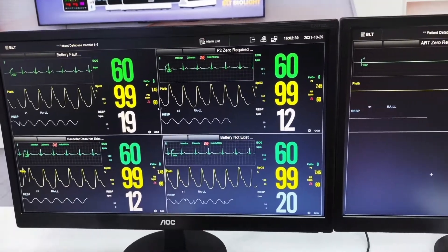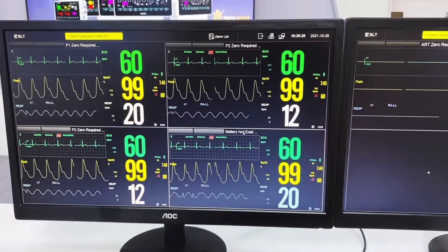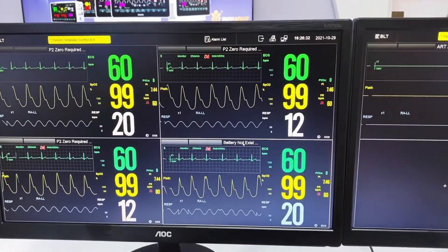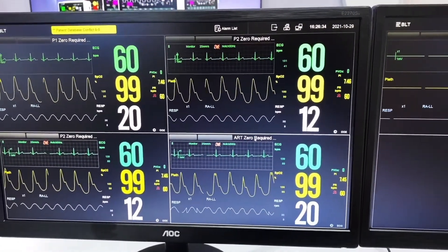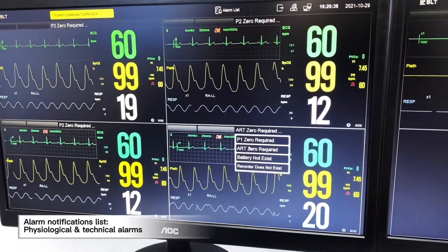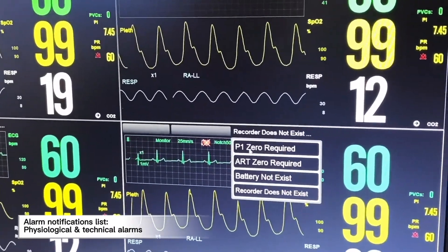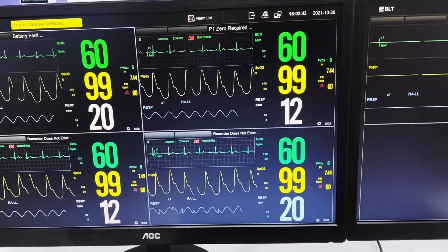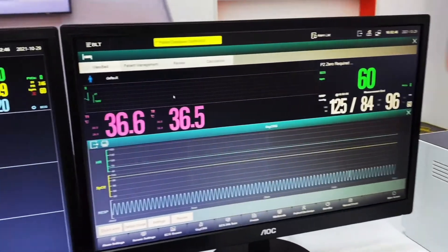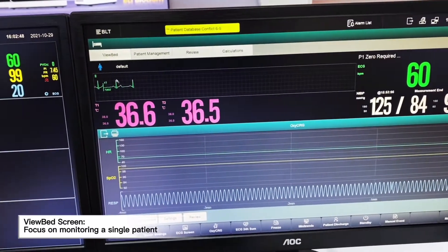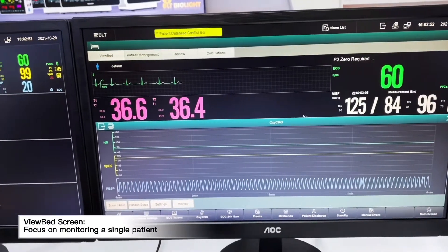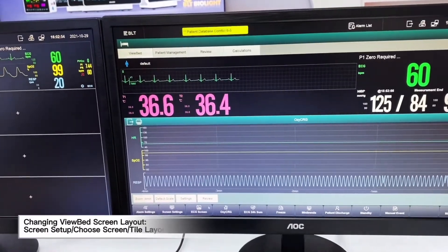When we go to the main page interface, we will be able to see the notifications. Once we click on it, we will be able to see the physiological alarms and technical alarms. We use the mouse to double-click on the first patient, and we will go to the view bed page, where we can expand ECG waveforms and change different displays.